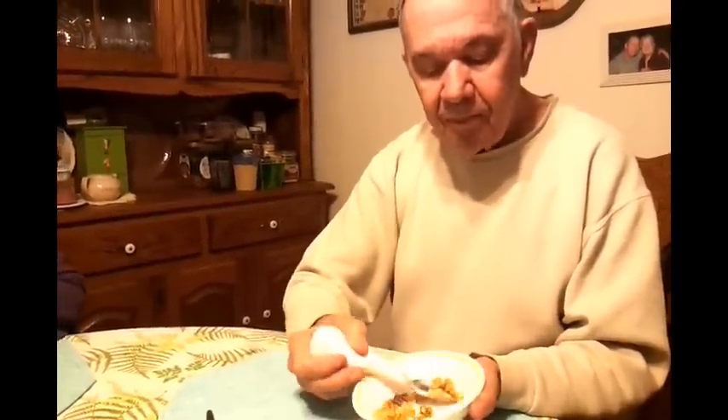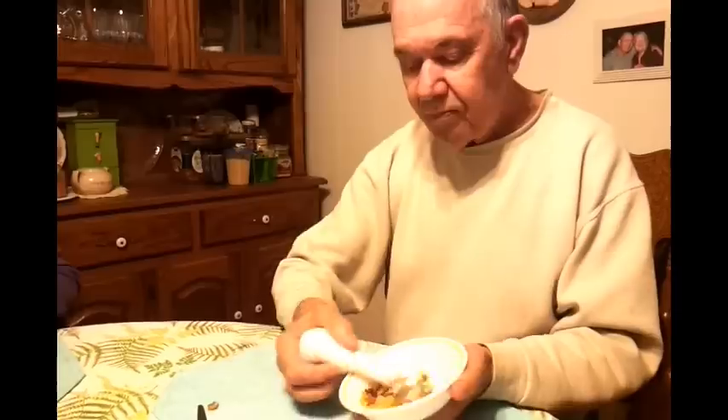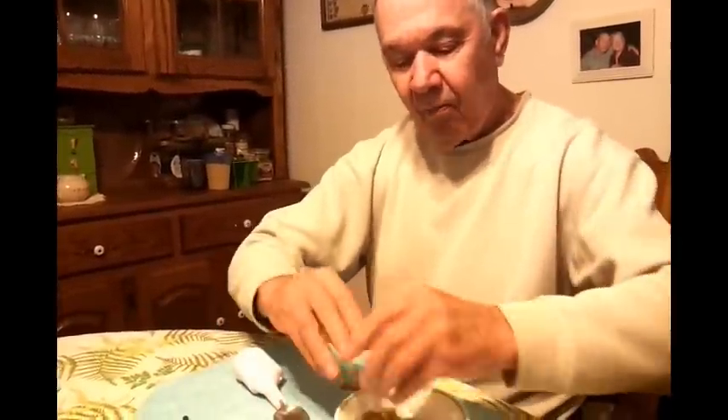Well, you know, they do have bowls that have kind of like a lip around the edge — an accessory on one side that he could use to scoop it up. Yeah, like for toddlers when they're trying to learn. Look at them. Yeah, that's it. Okay.